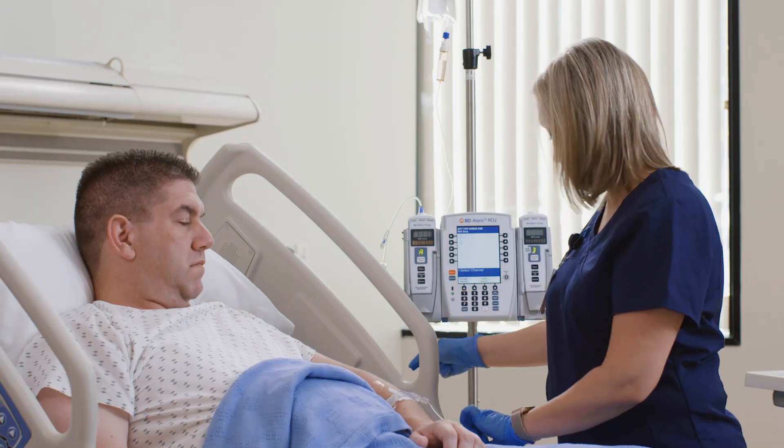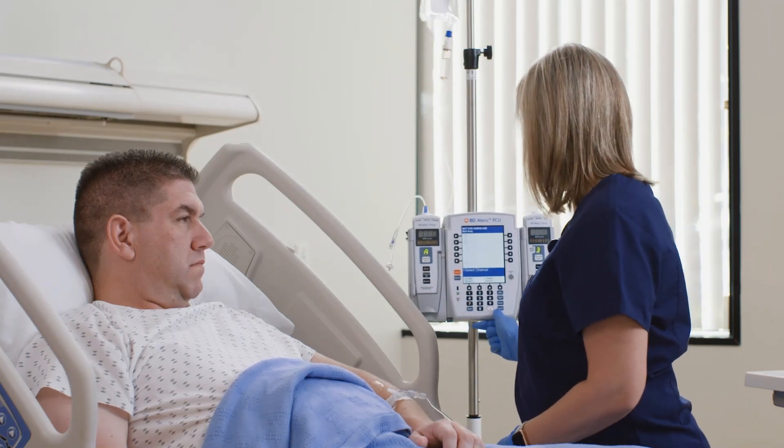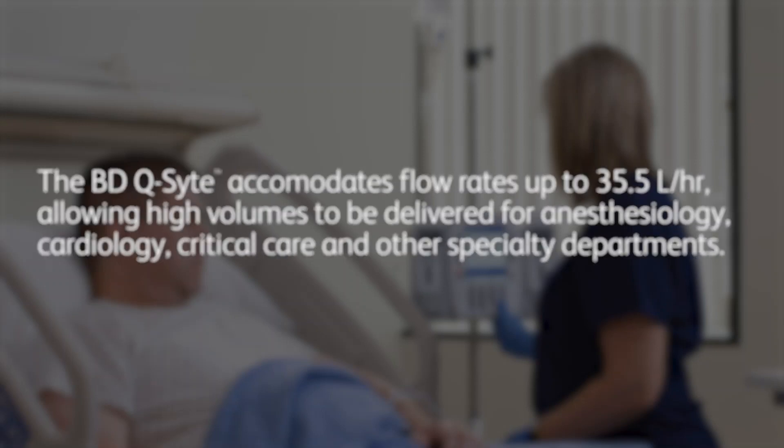Always trace your line prior to connecting to a device in order to avoid a misconnection. The BD Q-Site accommodates flow rates up to 35.5 liters per hour, allowing high volumes to be delivered for anesthesiology, cardiology, critical care, and other specialty departments.